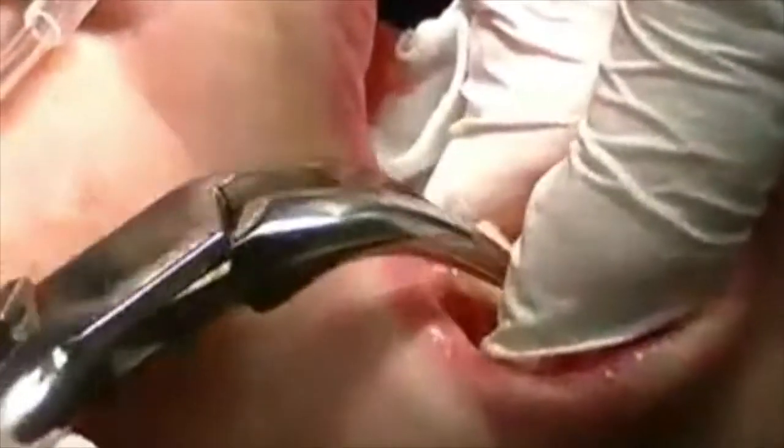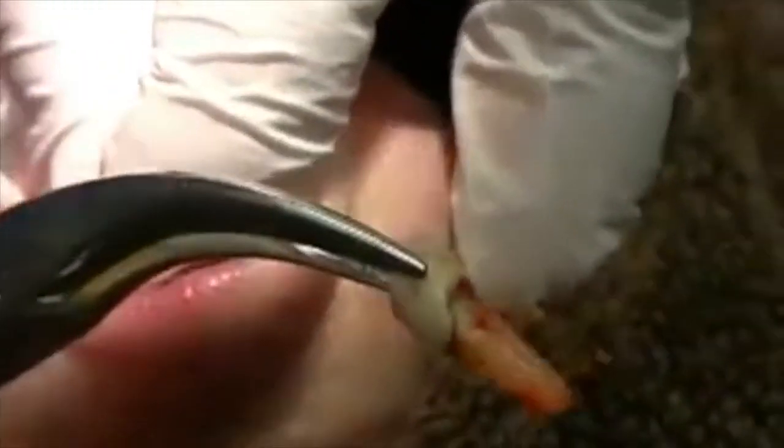Now let's see, I can just remove it with a simple forcep. The buccal plate is totally intact — I didn't expect that.